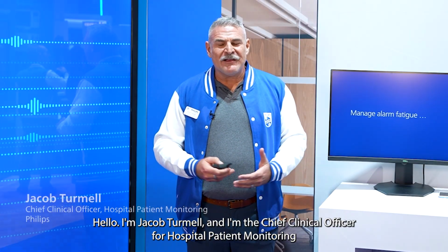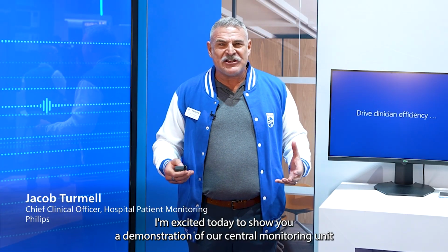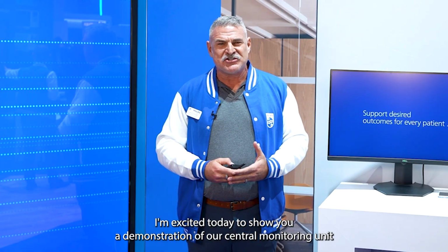Hello, I'm Jacob Turmell and I'm the Chief Clinical Officer for Hospital Patient Monitoring. I'm excited today to show you a demonstration of our central monitoring unit.